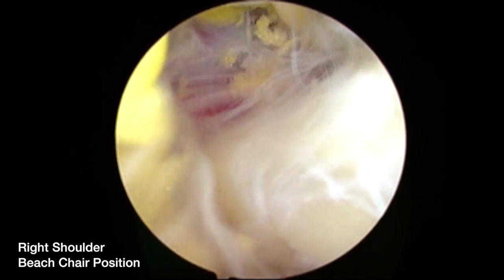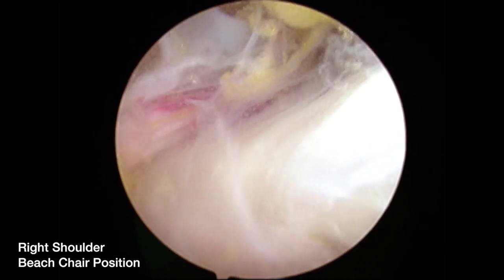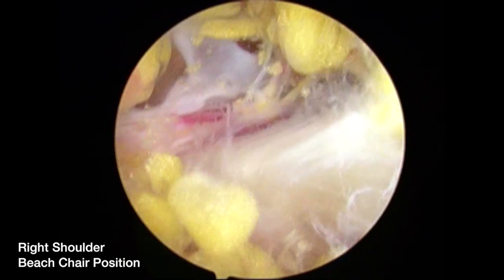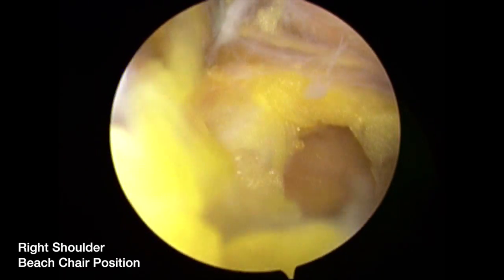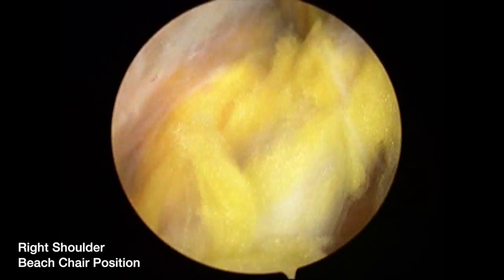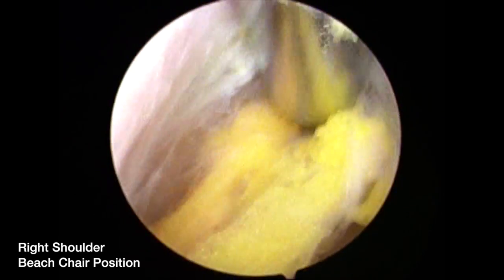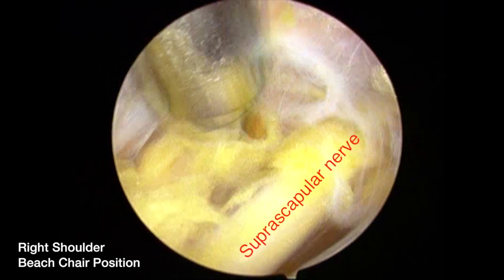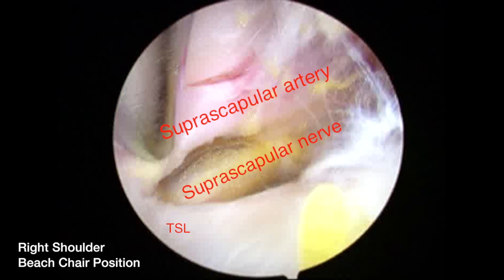The trocar is used to sweep any bursal tissue that may be blocking visualization. A shaver is inserted through the anterolateral portal. It's a right shoulder with the scope in the lateral subacromial portal. The artery is seen above the transverse scapular ligament. The trocar is being utilized here to further dissect the suprascapular nerve in the posterior medial aspect of the shoulder, prior to it passing under the transverse scapular ligament. As we move the scope out, you can see the nerve diving under the transverse scapular ligament with the artery above.